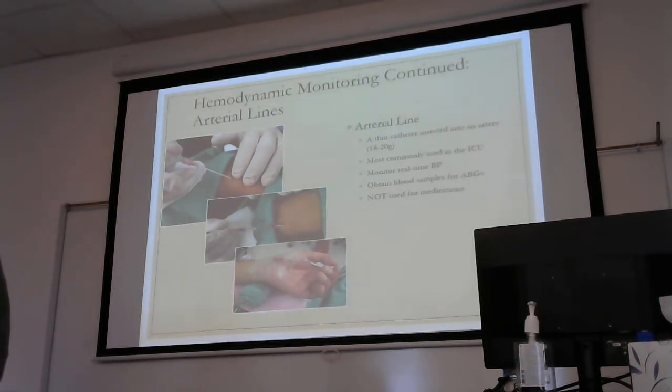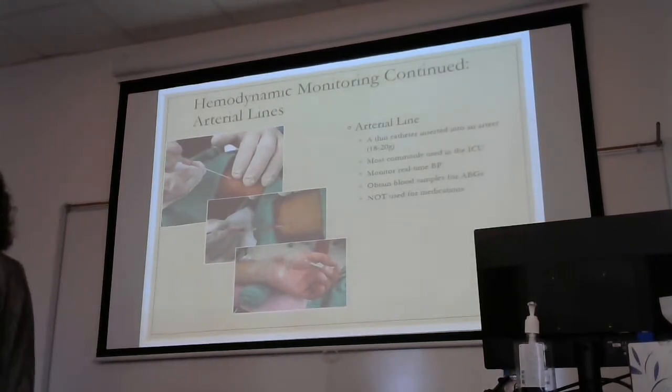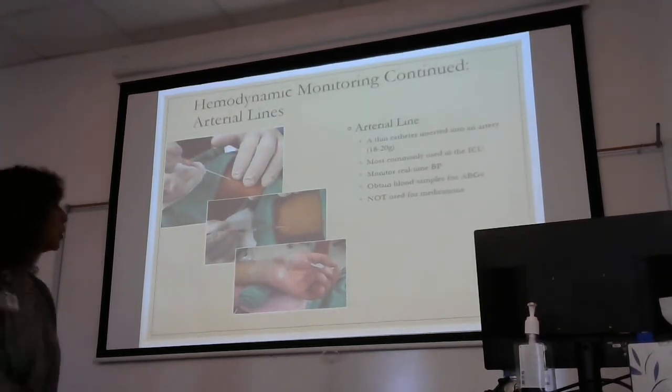Is that part of my documentation for a patient with this line? Absolutely. We'll be looking for that, that you looked at that. Has it been stabilized? If not, maybe I've got a patient who's not moving their extremities. Well, in that case, I don't need to stabilize it. Again, there's going to be a waveform.